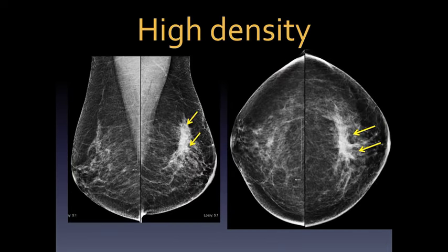Tangential views for skin calcifications can be done to confirm they are in the skin. This patient had very faint calcifications, and the technologist got a tangential view showing them in the skin, confirming the tattoo sign of skin calcifications. When you see typical lucent-centered calcifications, however, it's not essential to obtain tangential views — you can characterize them as typically benign.